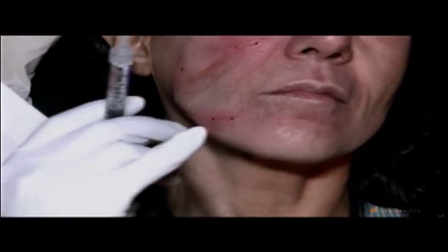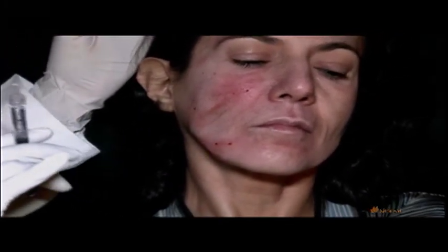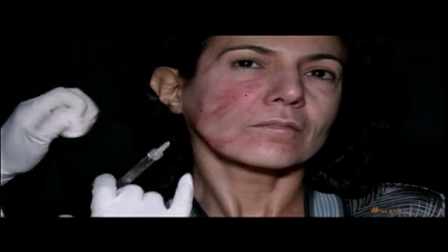I like to use a long needle quite often for superficial volumization. This is a 30-gauge 1-inch needle. It's a sharp needle again. And I just want to show you this tenting.